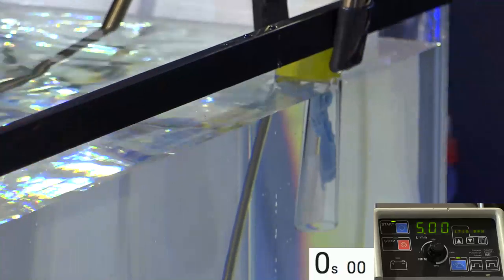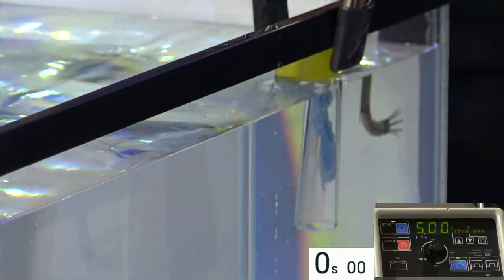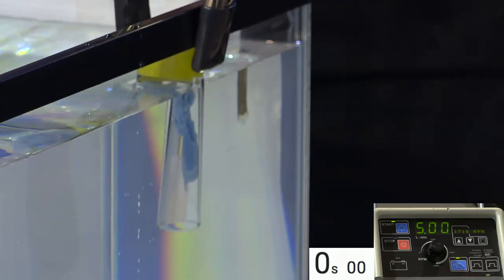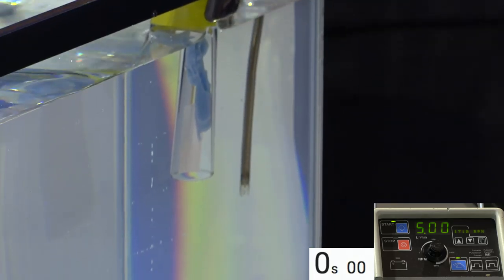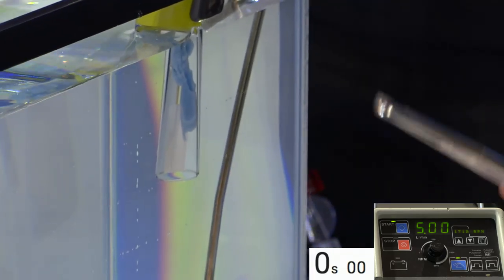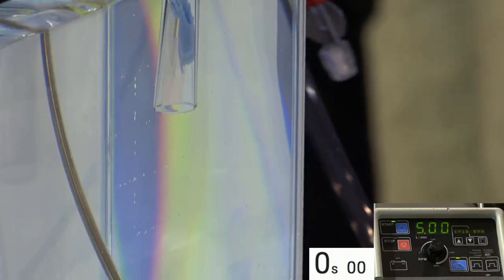Pretend like you're going into the right IJ like this, and as you come down, go ahead all the way back. There you go. Little air, though. That's okay. Come down like this and guide it with your hand. You're gonna have to do it with two hands. I'm gonna manage the pump, okay? So she's through the tricuspid valve, and now you watch the flow here, so don't engage anything yet, okay?